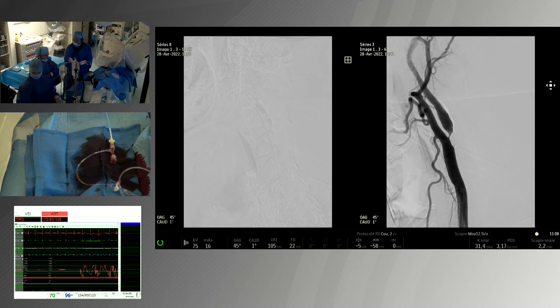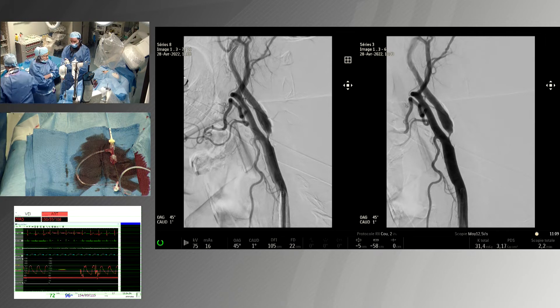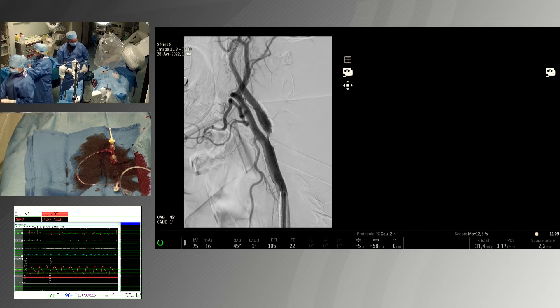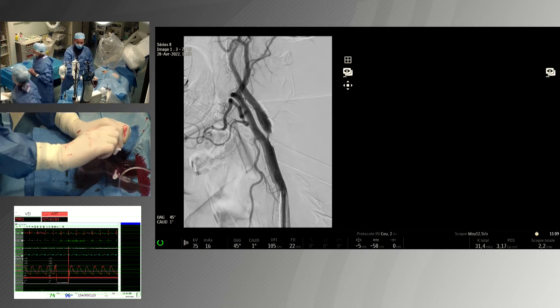Is it necessary to check after dilatation? You may have a bad surprise — you may have a thrombus that appears because it was a very ulcerated lesion. So it's important to understand what is happening.